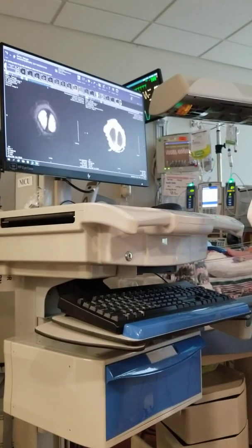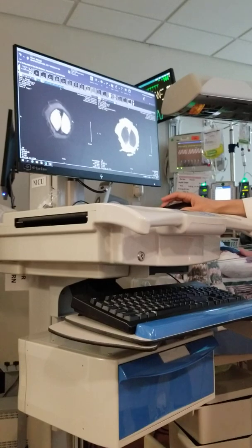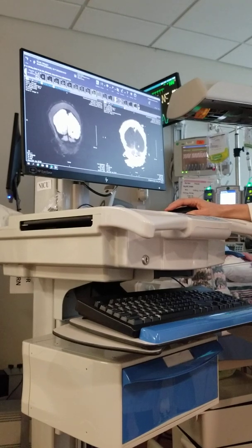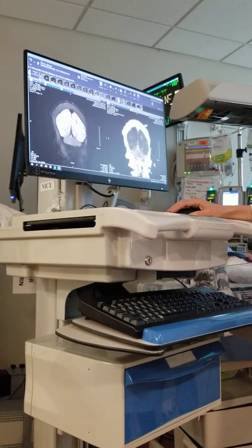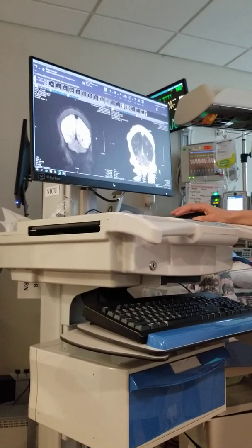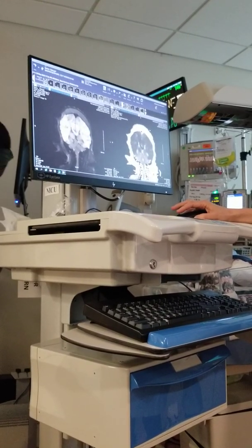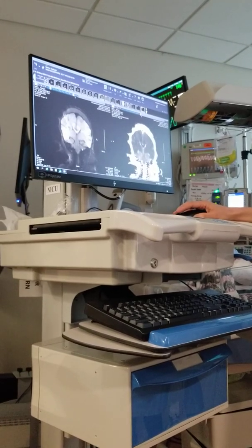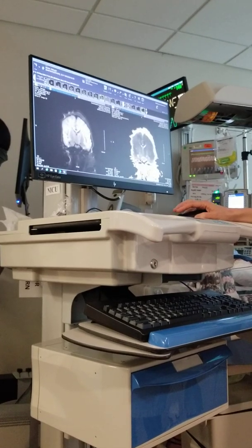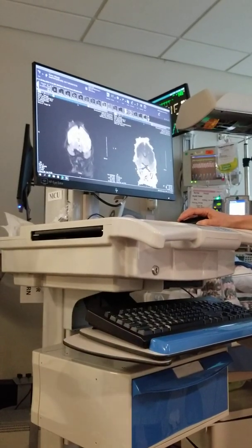You'll see the eyes. But anything that's bright, which you can tell is most of the tissue on this side, is way too bright. That means those are areas that were hurt by a stroke, did not get blood, and therefore they're hurt. Now the cerebellum is looking okay. It's not bright. That's a very small area. Maybe some of these little areas weren't hurt so badly, but most of the bilateral hemispheres of the brain are hurt. The brain stem itself doesn't have much effect to it yet.